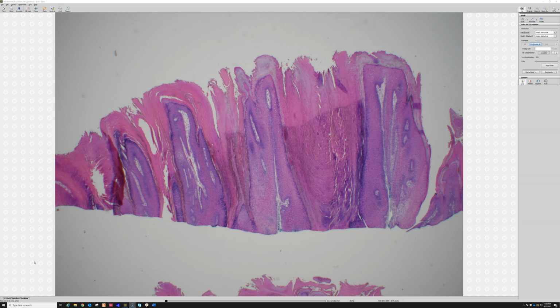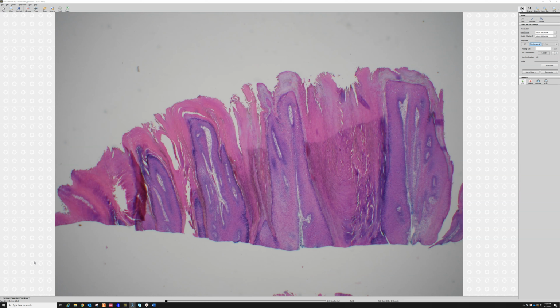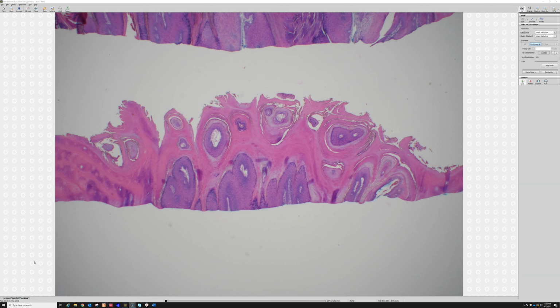And look, this dermatologist did a great shave. It's a huge, thick piece of tissue, but this wart was a really thick, deep wart. So sometimes it's just not possible. And that's, I think, particularly a problem on warts with horns and also warts on acral surfaces. I think this was on the thumb or somewhere, if I recall. So we're just seeing the top of it.